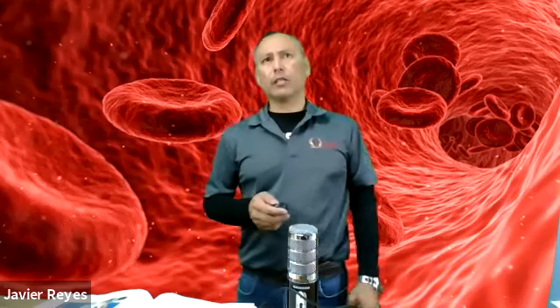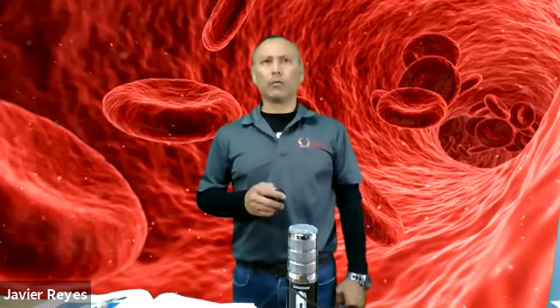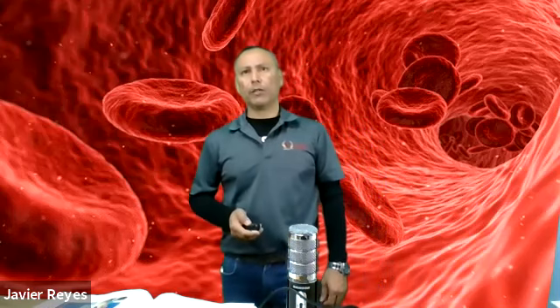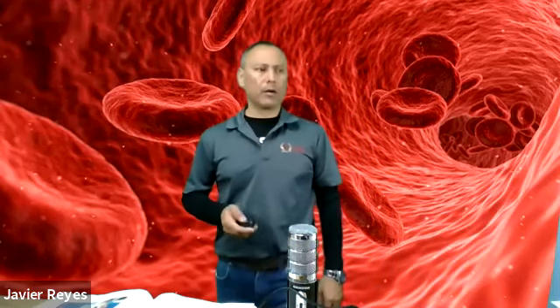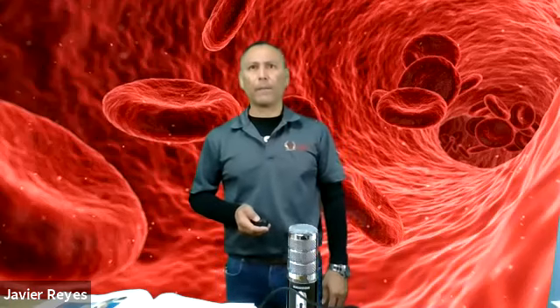Again, capillary specimen collection is especially useful for pediatric patients in whom removal of a larger quantity of blood through venipuncture can have serious consequences. So you must always verify with your physicians, the primary caregivers, the nurses, whoever is in charge of that patient, so that you can collect the right amounts of blood.